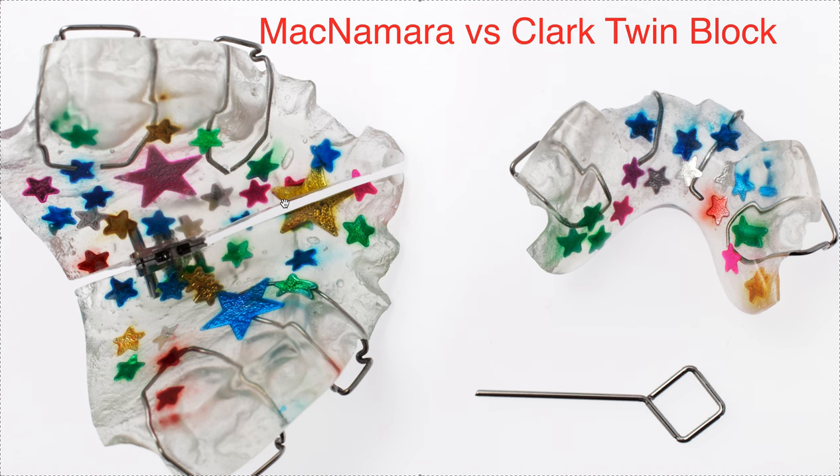Just be clear. Say, I want a twin block with upper and lower transverse screw. Or, I want a twin block with no screw and a labial bow for extra retention. That's my suggestion — just be as clear as possible with what you need, and maybe just don't call it McNamara versus Clark twin block.